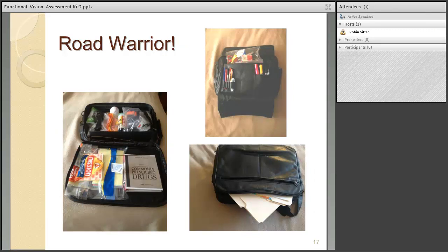So let's pack it up. You see all the individual bags, and as you saw throughout the presentation, they just fold up here, so each thing is grouped together with things that are like it, so they're very easy to grab and pull out. Office supplies and pins on the outside pouch where they're easy to get to without having to open the whole bag, and files in the file pouch on the opposite side.